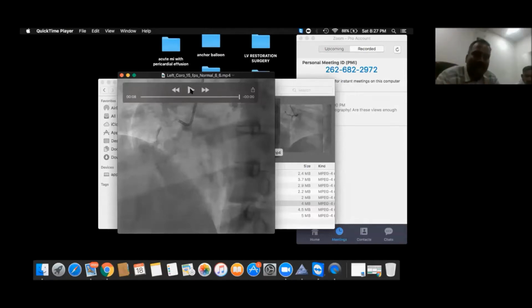But see, in an angiogram, you have only one puncture. It is very difficult to give a dual injection. You can use all these kinds of analysis to understand the length of the CTO. I have not given a dual injection to make my point clear, but I have observed so many cases. So, this is how it looks. The moment you give a dual injection, you can see your entire distal RCA, because now you are sending contrast through both routes, your entire distal RCA will be visible.